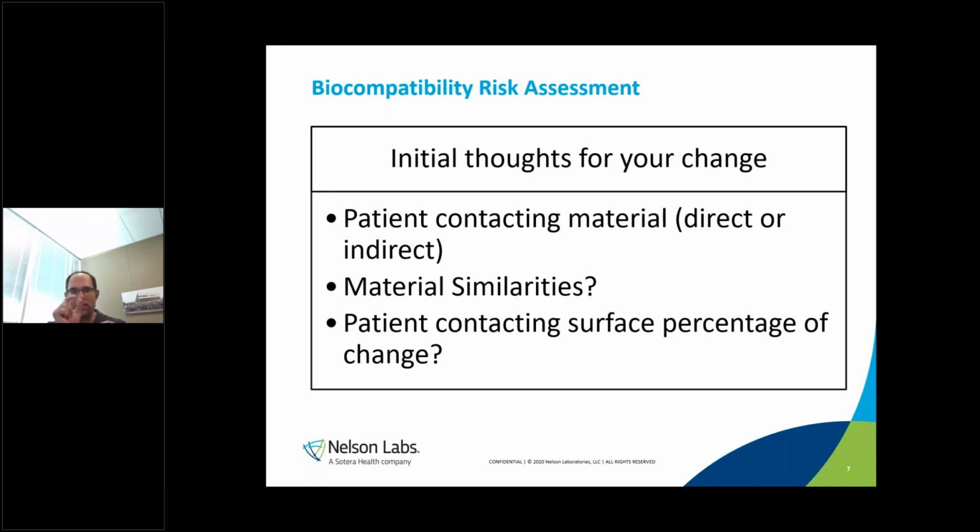If you're testing only the same surface area of different materials in like a coupon or a family device, but the worst case one has more of a certain material, we want to make sure that we test the right ratio, the worst case ratio. So just make sure you work with your lab or your biocomp experts when you're doing initial testing on something like that to make sure your surface area ratios are good, because it plays in the case here with the change.